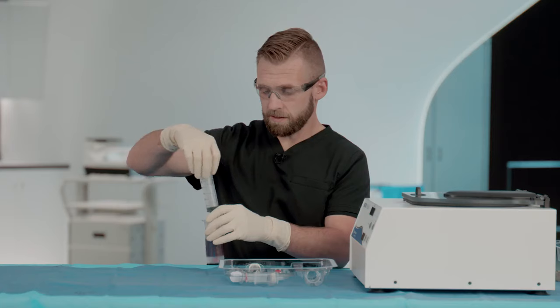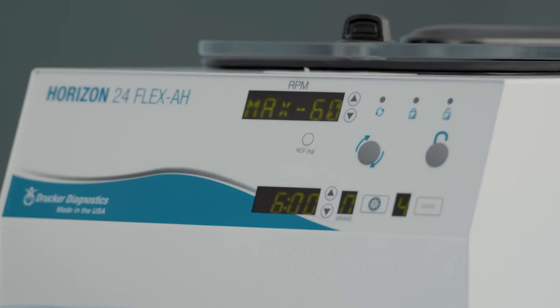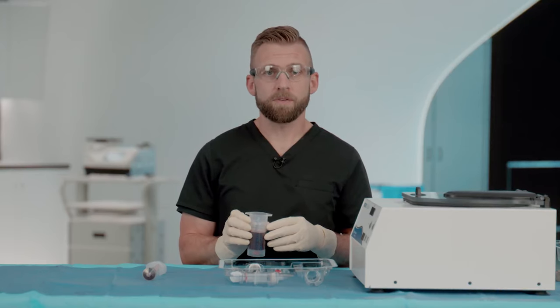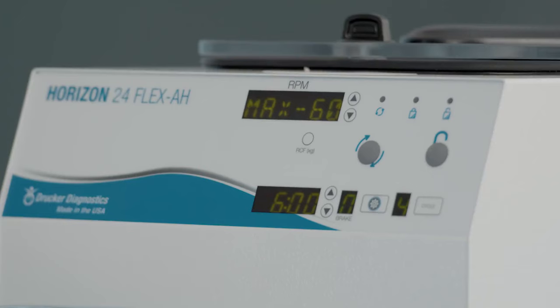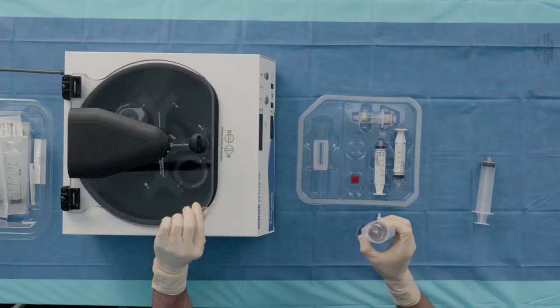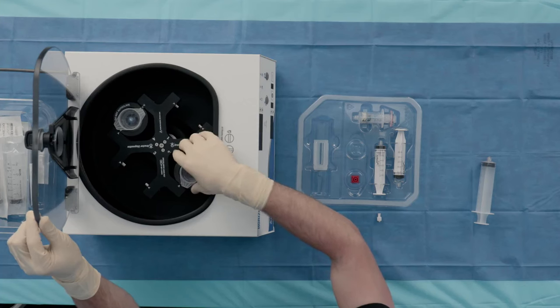The ACP Max system uses a dual-spin process, and in the first spin, we'll centrifuge the ACP Max syringe at 3,200 RPMs. The time on the first spin is variable depending on the volume. For the 60 mL volume, we'll spin for six minutes. We've prepared an appropriately measured counterweight. At this stage, we'll place the ACP Max syringe and the counterweight across from each other and spin.